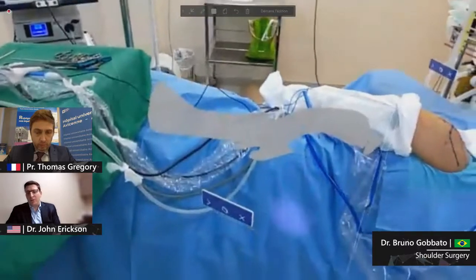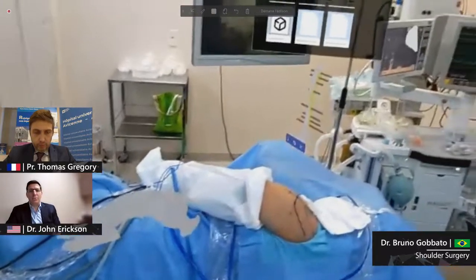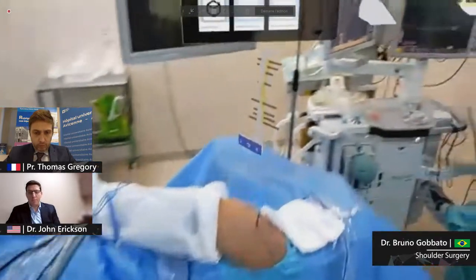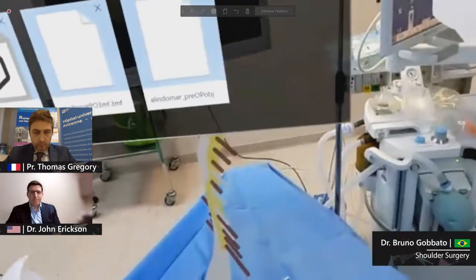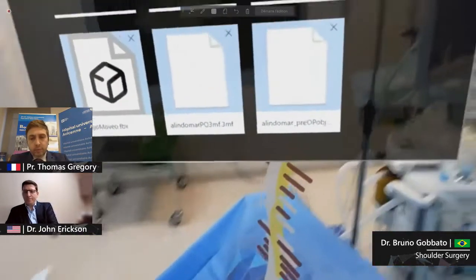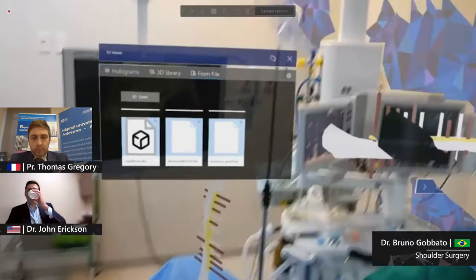And while he, like you said, probably would heal, I think he'll do better with surgical intervention. So I would have offered this patient surgery as well. We have already removed the plate. There is nothing else to show here. And we're going to do an arthroscopy.